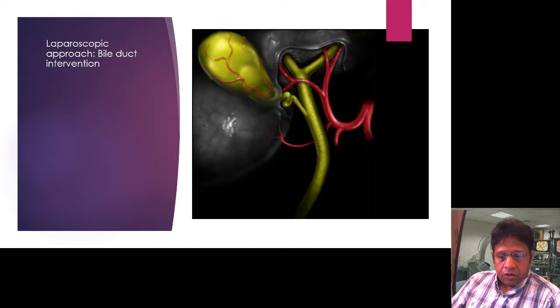They positioned it appropriately, deployed it, and they even showed a post-procedure image showing excellent flow of contrast into the duodenum. And 6 days later, the cholangiogram done through the Dawson-Mueller catheter, which was placed again over the guide wire, showed that the self-expanding metal stent had slowly expanded over the next few days and opened up the stricture very nicely.